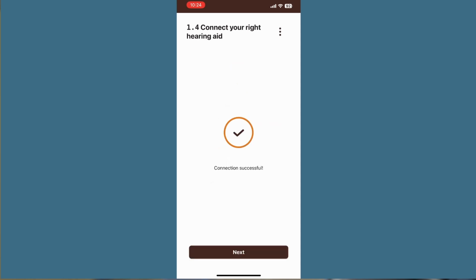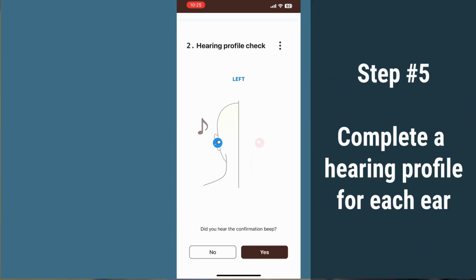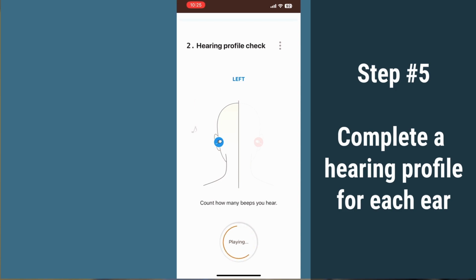Once both hearing aids are connected to the app, the next step is to establish a hearing profile. For the hearing profile, you're going to hear a series of beeps, and you have to indicate whether you heard 0, 1, 2, 3, or 4 beeps. It goes through this several times, both on the right and the left. We cut this down a little bit just for shortening up the video.